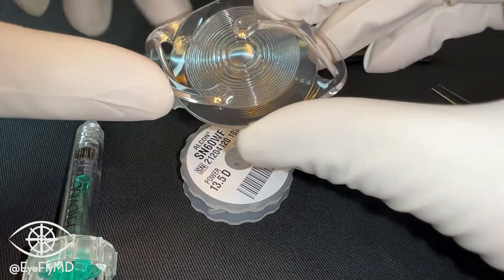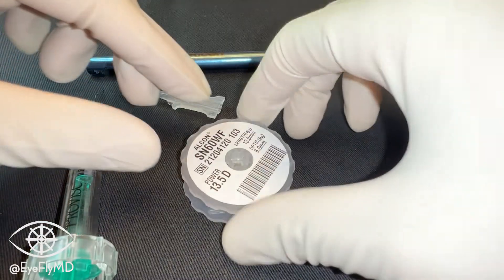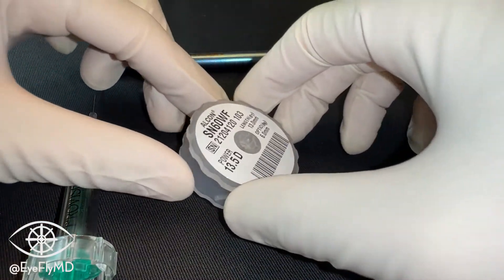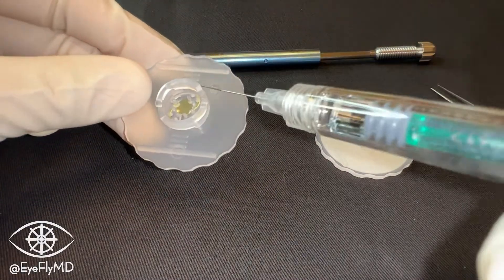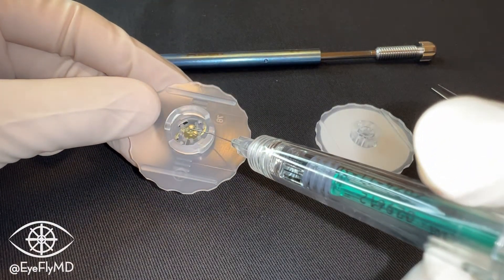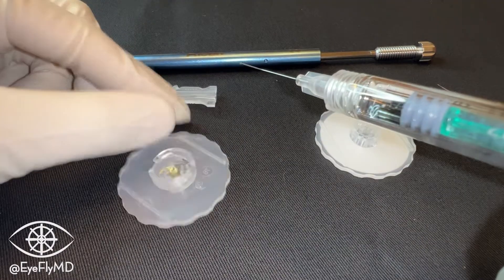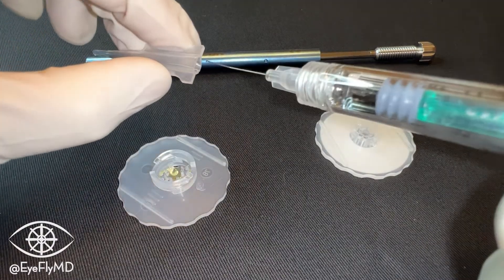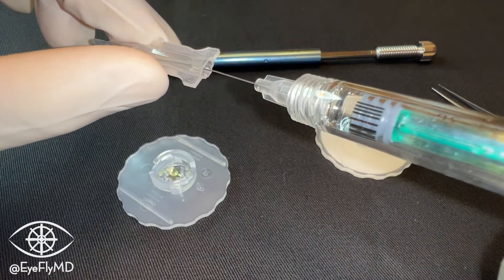So again, leading using the cartridge and then tucking the trailing haptic with the forceps. First we'll open our IOL and place a little cohesive OVD — a little dot on both the optic of the IOL and a little bit on the cartridge off to the side that we'll use to dip the IOL in once we retrieve it. We'll also fill the cartridge from both the front and the back to make sure it's all the way full of OVD.